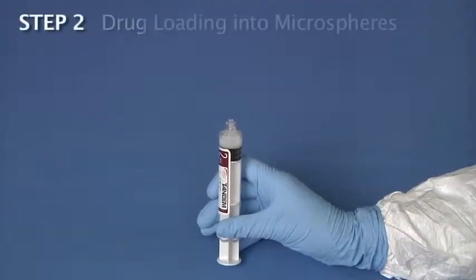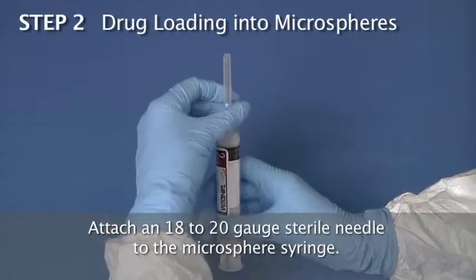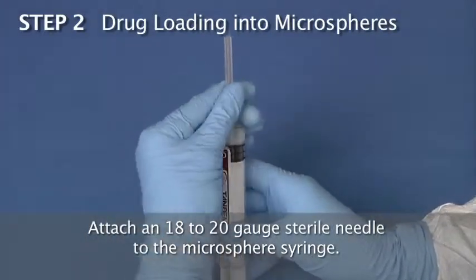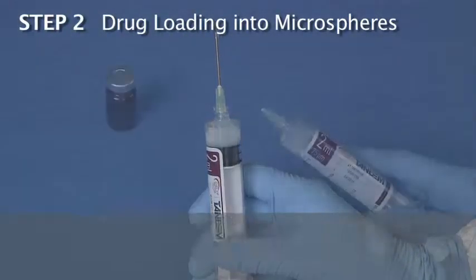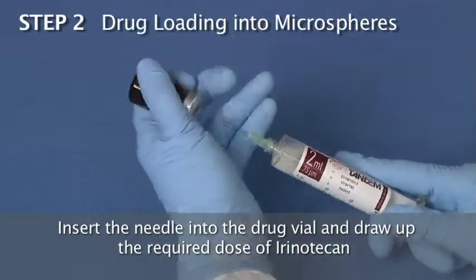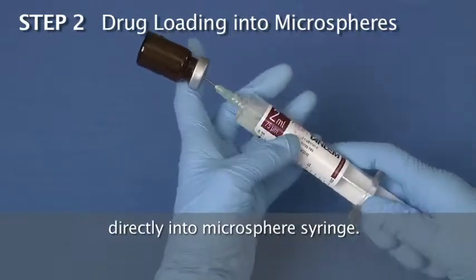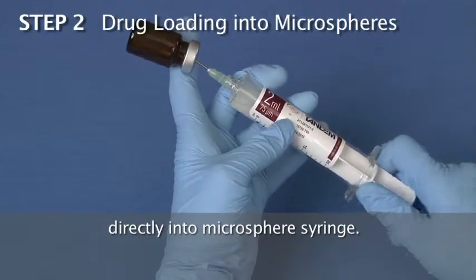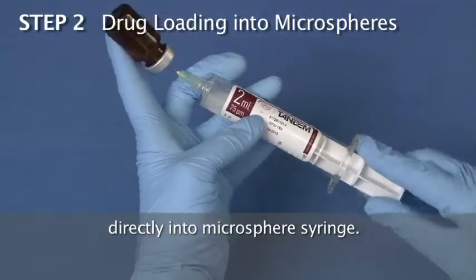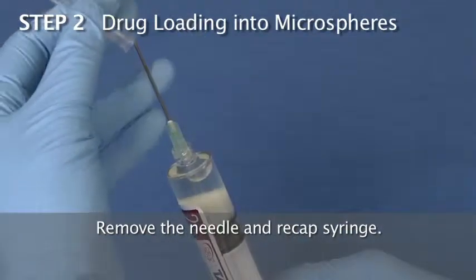Step 2. Drug loading into microspheres. Attach an 18 to 20 gauge sterile needle to the microsphere syringe. Insert the needle into the drug vial and draw up the required dose of Irinotecan directly into the microsphere syringe. Leave an air bubble in the microsphere syringe in order to aid in mixing. Remove the needle and recap the syringe.